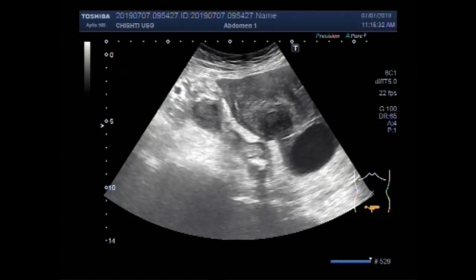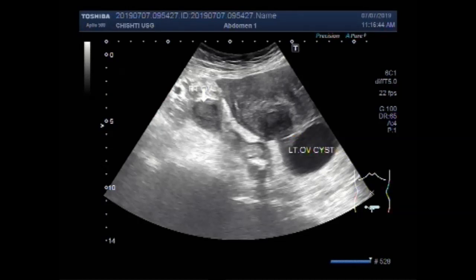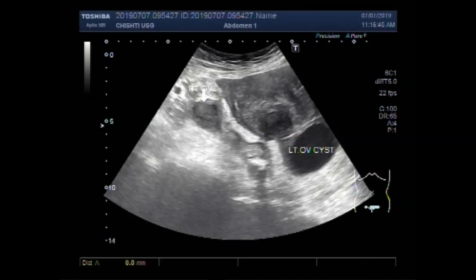Now you can see both the ovaries. This is the right ovary — it also has a significant amount of thick fluid in it. This is the left ovarian cyst, which measures about 4.4 cm by 3.8 cm.